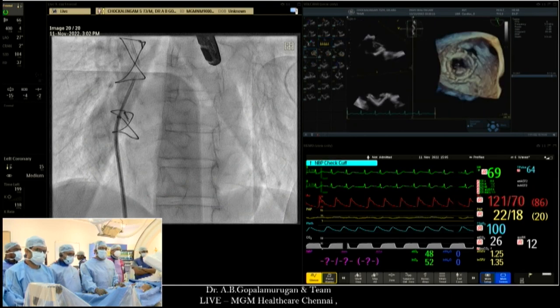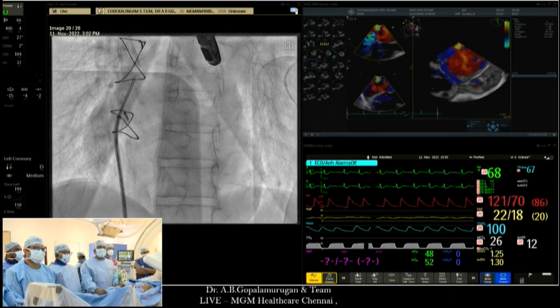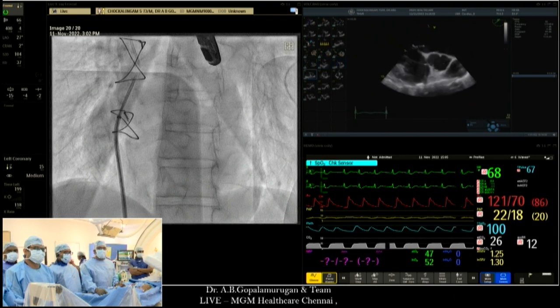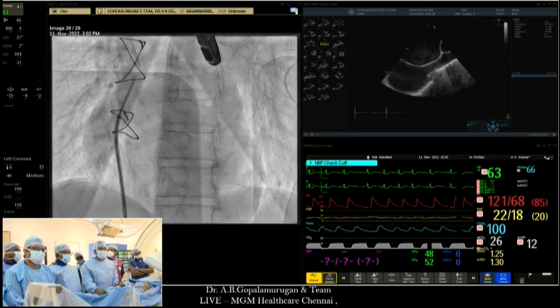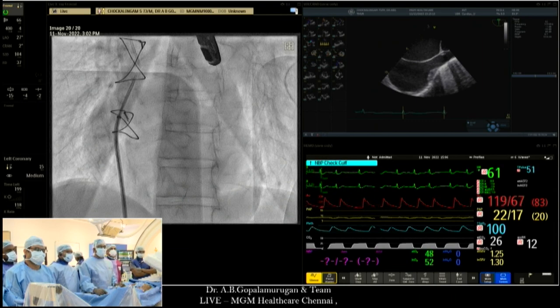We are in the difficult part of the procedure, which is the transseptal access. His left atrium is huge. The CT analysis we have already shown you. The neo-LVOT is fairly generous, so we don't anticipate the dreaded complication, which is LVOT obstruction. Otherwise, one had to resort to other maneuvers. For this case, we don't anticipate LVOT obstruction. The main issue is getting a good transseptal, for the reasons I'm going to show you right now. I'll let you get on with your discussion, or I can show you where we are right now.